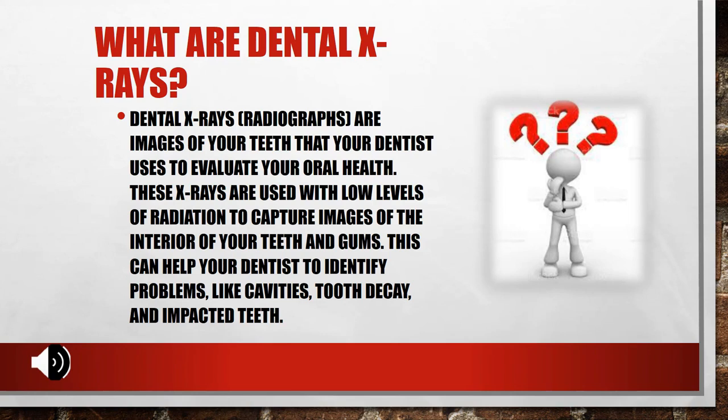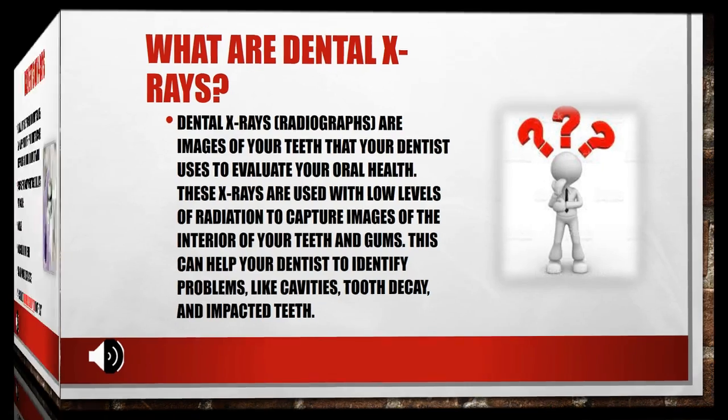So let's ask the question, what are dental x-rays? Dental x-rays are images taken of the teeth by using low levels of radiation to capture these images. This may be in the intraoral environment or the extraoral environment. This can provide a means of the dentist assessing various different types of problems. These problems can include cavities, tooth decay, and impacted teeth. It also aids the clinician in adequately planning treatment.